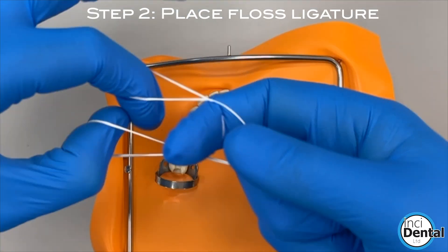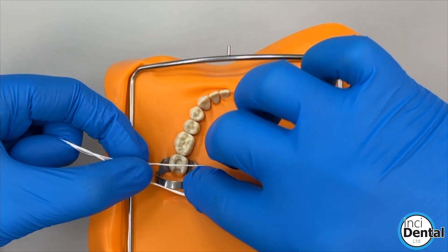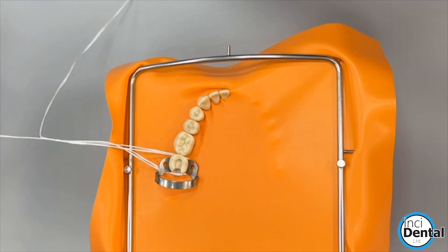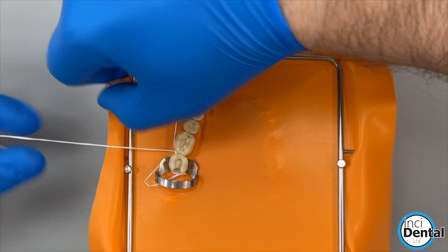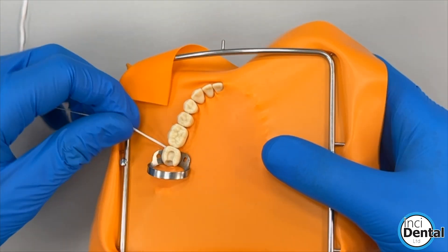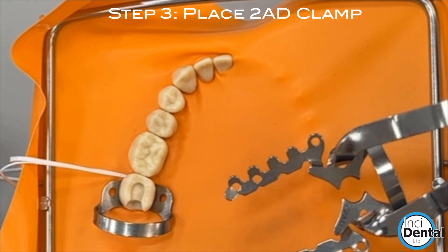We can then tie a quick floss ligature to easily go around the clamp tooth just to hold things down. Now, once that's in position, you then apply the 2AD clamp.